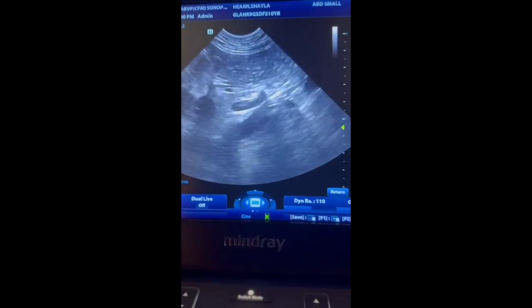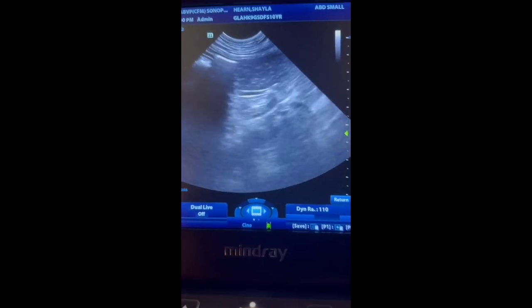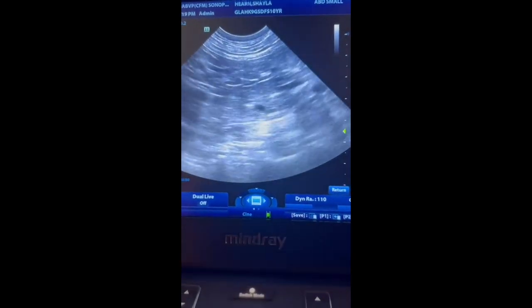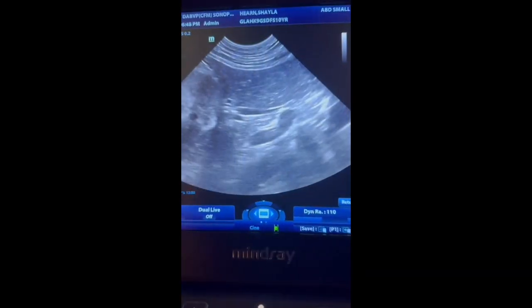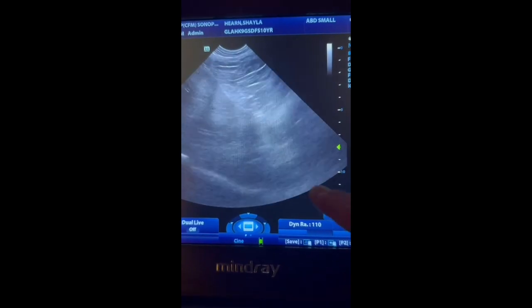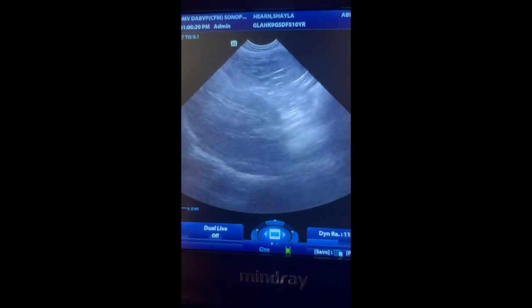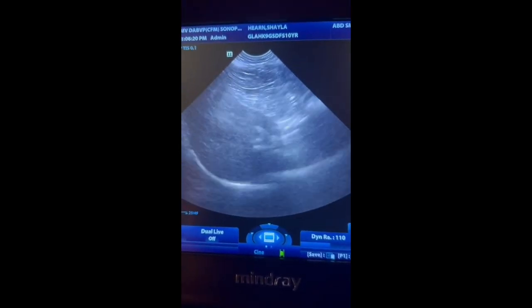And then when you get to the left adrenal gland, this is about 5 centimeters, but the left adrenal looks prettier as well if you have better acoustic power, which this one has better acoustic power than the last models that I showed you earlier. And then the right adrenal as well at 5 centimeters. So that's the way to assess your resolution depth on your machine. So make sure you're at least at 8 to 10 centimeters solid on challenging animals. And again, this is a 10-year-old German Shepherd, about 70, 80 pounds.